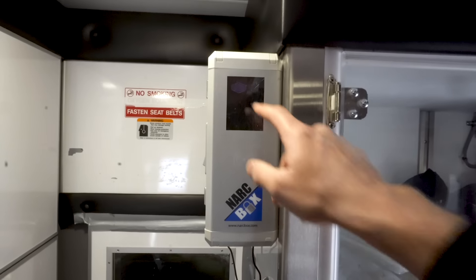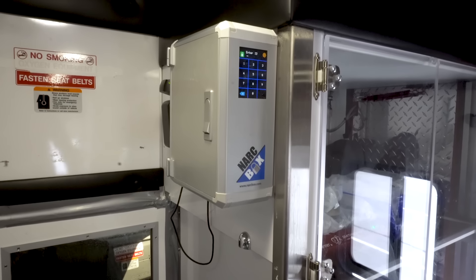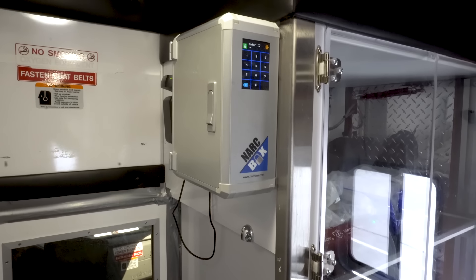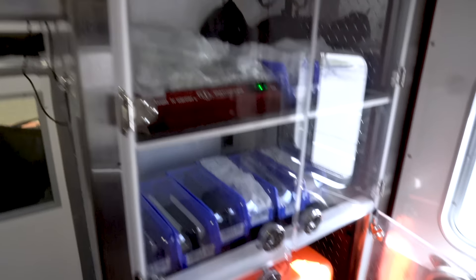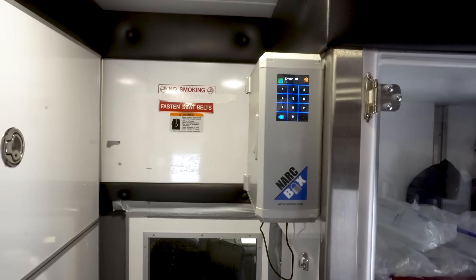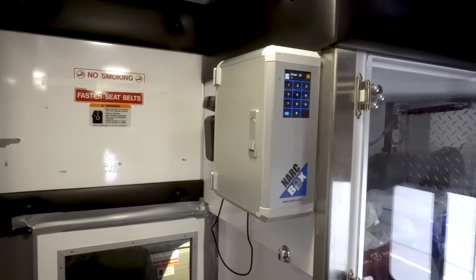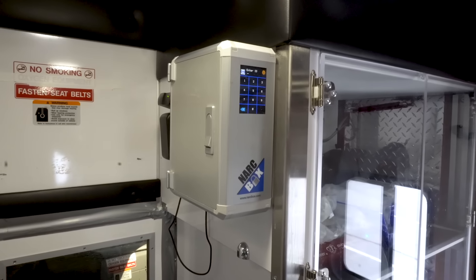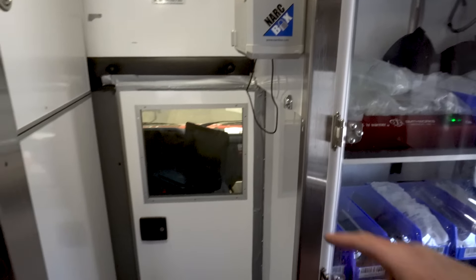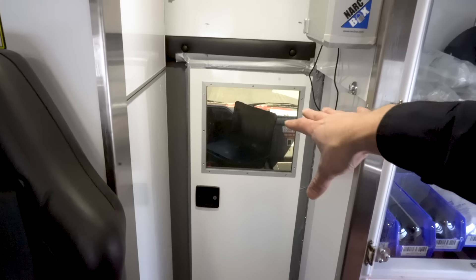Right up here, we have our NARC box — an RFID NARC box. They're hooked up so everybody has their own ID to open it. All the controlled substances are kept up here for security purposes, and it tracks whoever logs in. We have to check and log these every day and every time we give them. Because of COVID-19, we have the front compartment completely sealed with tape so nothing can get through, and when this truck gets ready for deployment, we do a plastic drape over there as well.